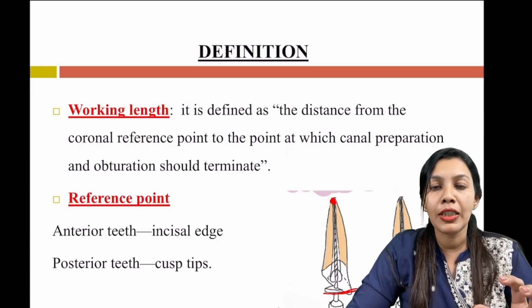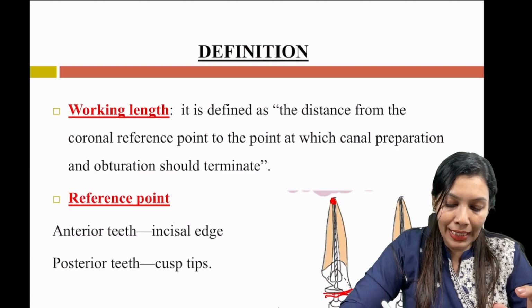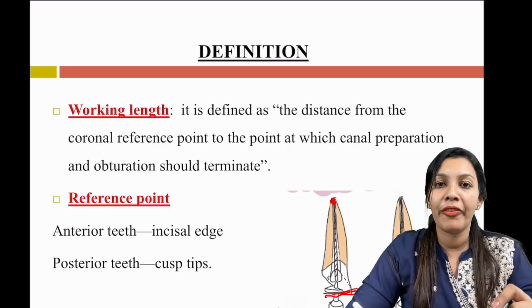So what is a reference point? In the case of an anterior tooth, the reference point is always the incisal edge, while in the case of posterior teeth, it is any of the cusp tips that is taken as the reference point.